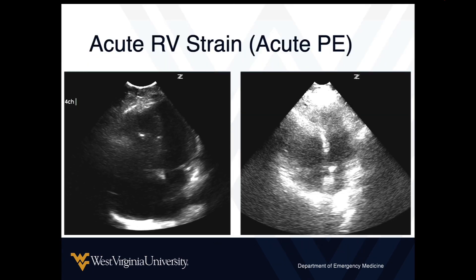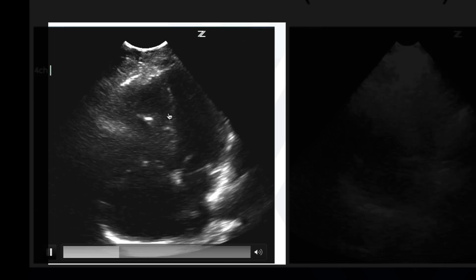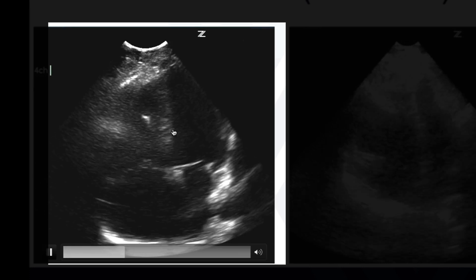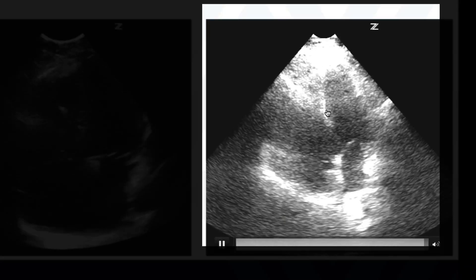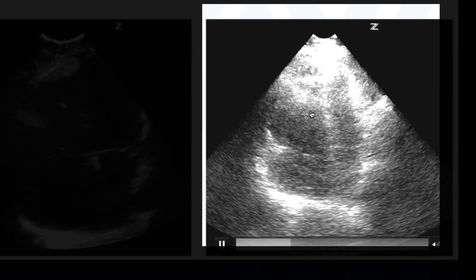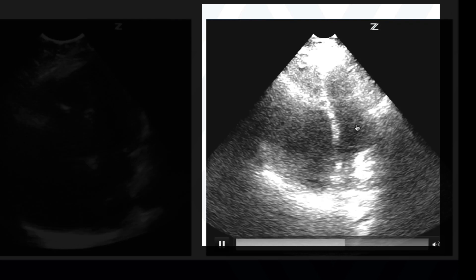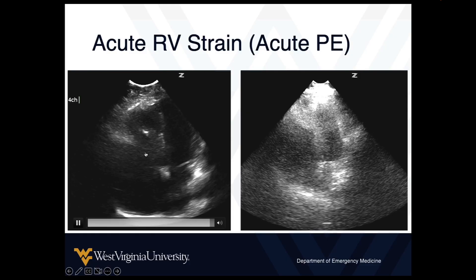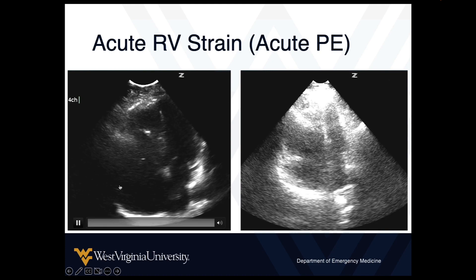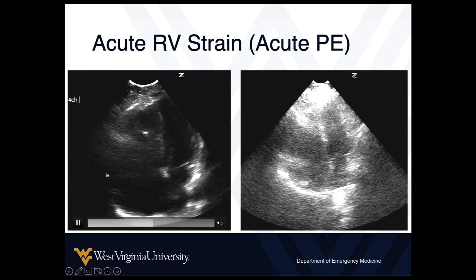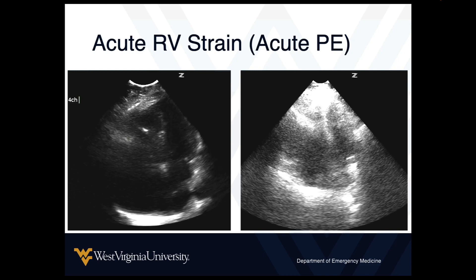Here are more examples where we see a large dilated right ventricle with compression of the left, and the septum moving towards the left during diastole. Again, very large right ventricle, left ventricle compressed, septum pushing to the left. This case may have some degree of chronicity, as we see an enlarged right atrium — a good example of how we have to incorporate the entire clinical picture.